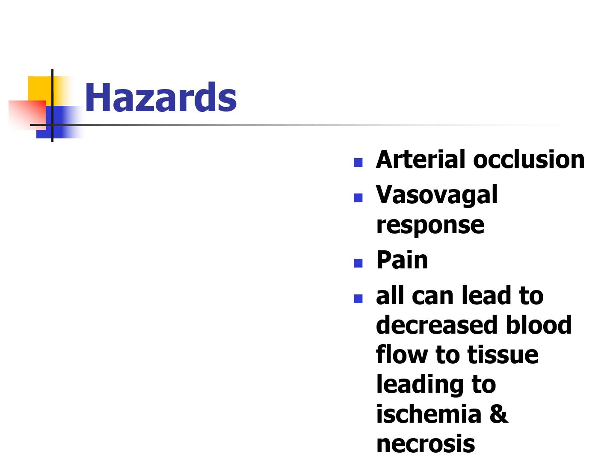All right, hazards of blood gas. This can freak a lot of people out, and that's understandable. I absolutely get it. I remember being so nervous before doing blood gases. Even with our fake arm in the lab, I was shaking, so nervous. Now I've done probably easily over 1,000 blood gases in my career.